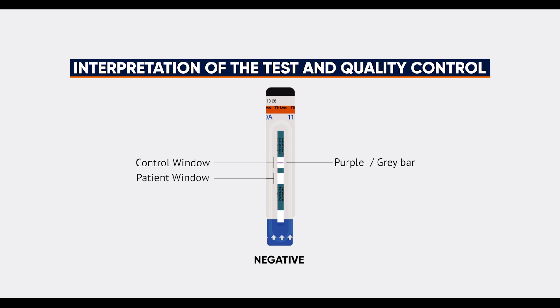The appearance of one purple or grey bar in the control window of the strip, labelled 'control', and no purple or grey bar in the patient window, labelled 'patient', indicates the TB-LAM result is negative.